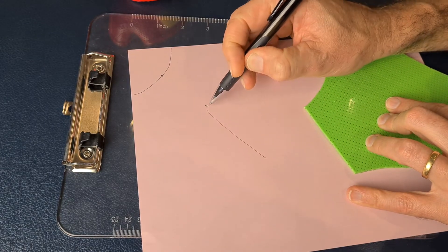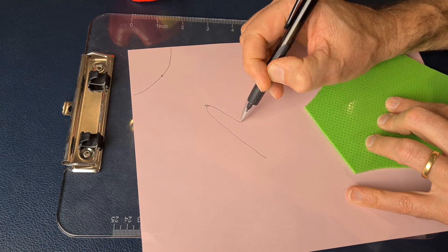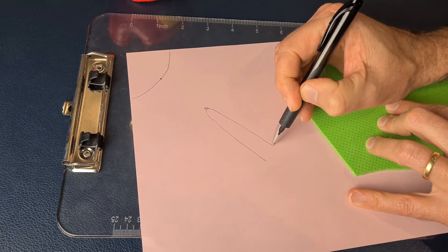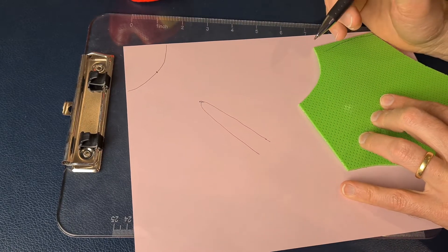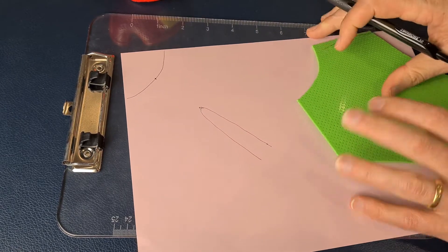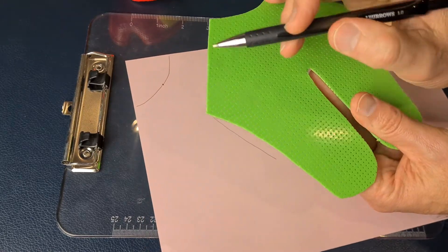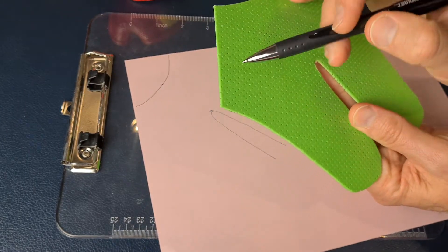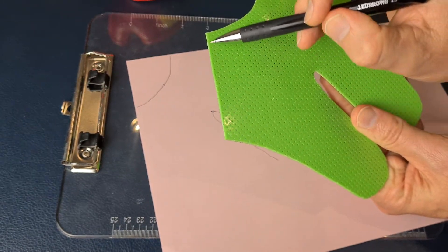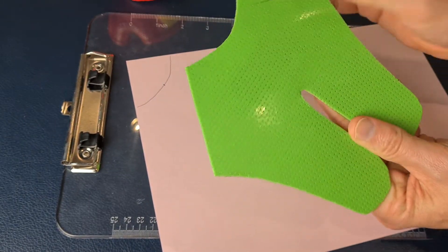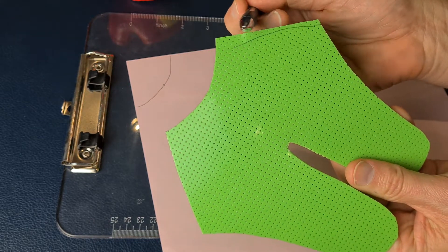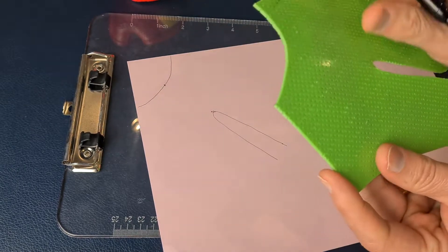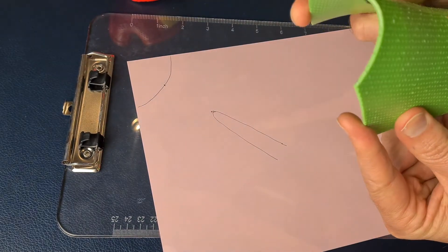The next measurement you need to take—the final measurement really—is this distance here, which will be equal to that distance there, because those sides are going to come around together and form this seam down the radial border of the splint.